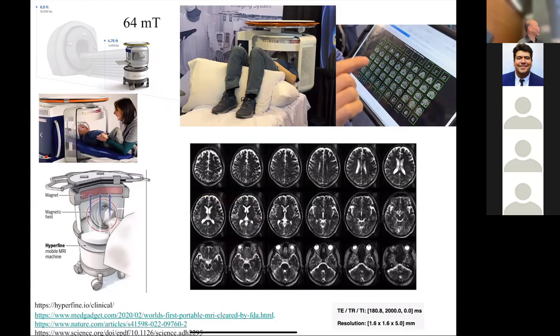Okay. So the other thing that's happened is, we'll talk in this course about how traditionally most MRI scanning and reconstruction has been Fourier based. And it's only in the last 10 years, with the improvements in deep learning and AI, that people have been able to move away from the Fourier based approach and collect much less data and create reasonably good looking images. So we'll get into that a little bit, because that is sort of the state of the art for medical imaging now.